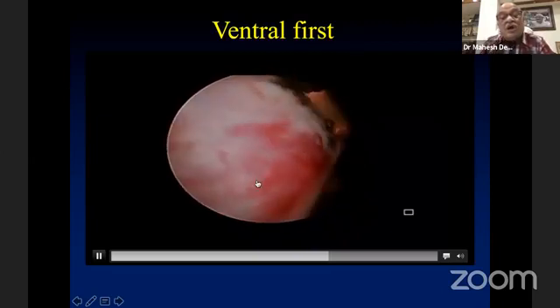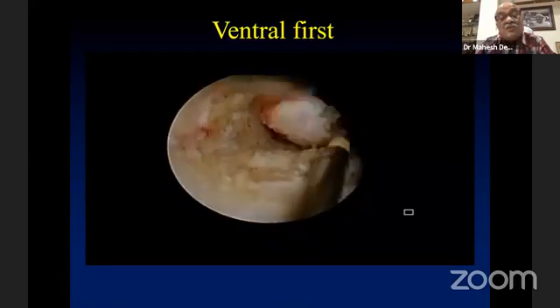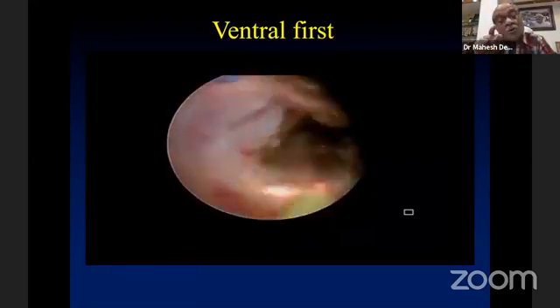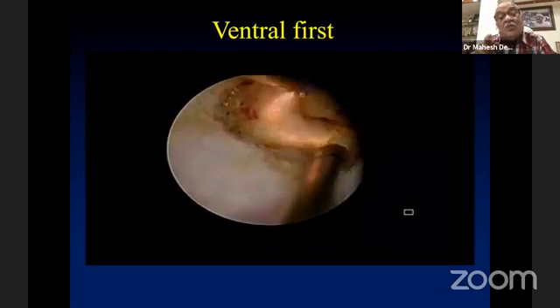Now I'm going to the other lobe, and here you can see the bleeding, and that's the blood vessel I want to stop. Now remember one thing: this is where, if you have severe bleeding post-operatively, usually you go and look for this spot, because from there you can have a large bleeding point if it is not controlled properly in the early phase.